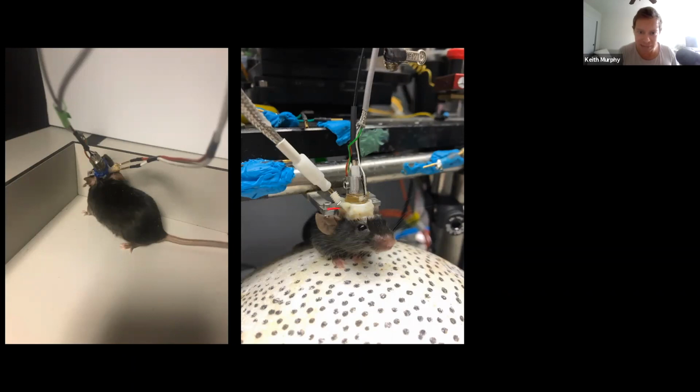So here is the head bar. You can actually screw them into a bracket, which is shown here. And then underneath the animal, you can put this styrofoam ball where we flow a little bit of air under the ball so it freely spins under the animal, and the animal can run on the ball as if it's sort of freely behaving. So you can see the animal's comfortable, and still all of our recording equipment is now unconstrained.